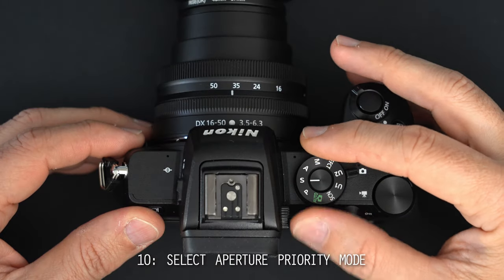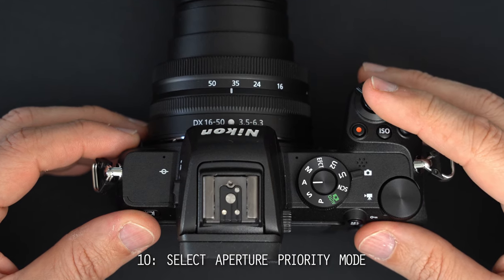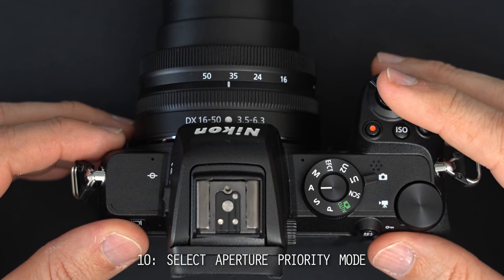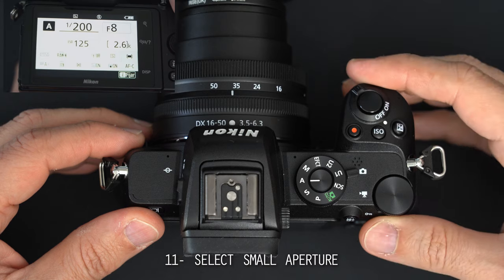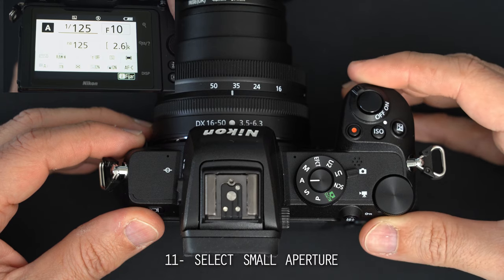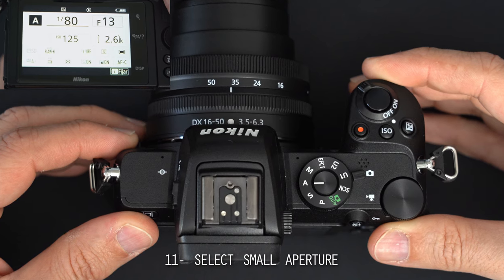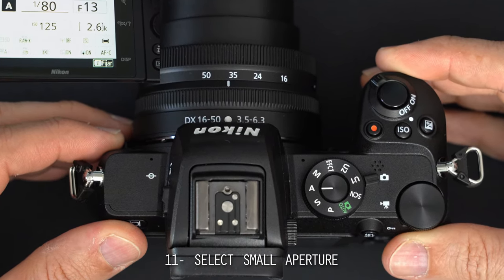Recommendation number 10 talks about setting up the camera to the semi-automatic mode A, or aperture priority mode. In Canon cameras it is also called AV mode. You only need to turn the corresponding dial to select a small aperture, such as F8, 11, 13, 16 or even smaller, depending on the camera and the lens.